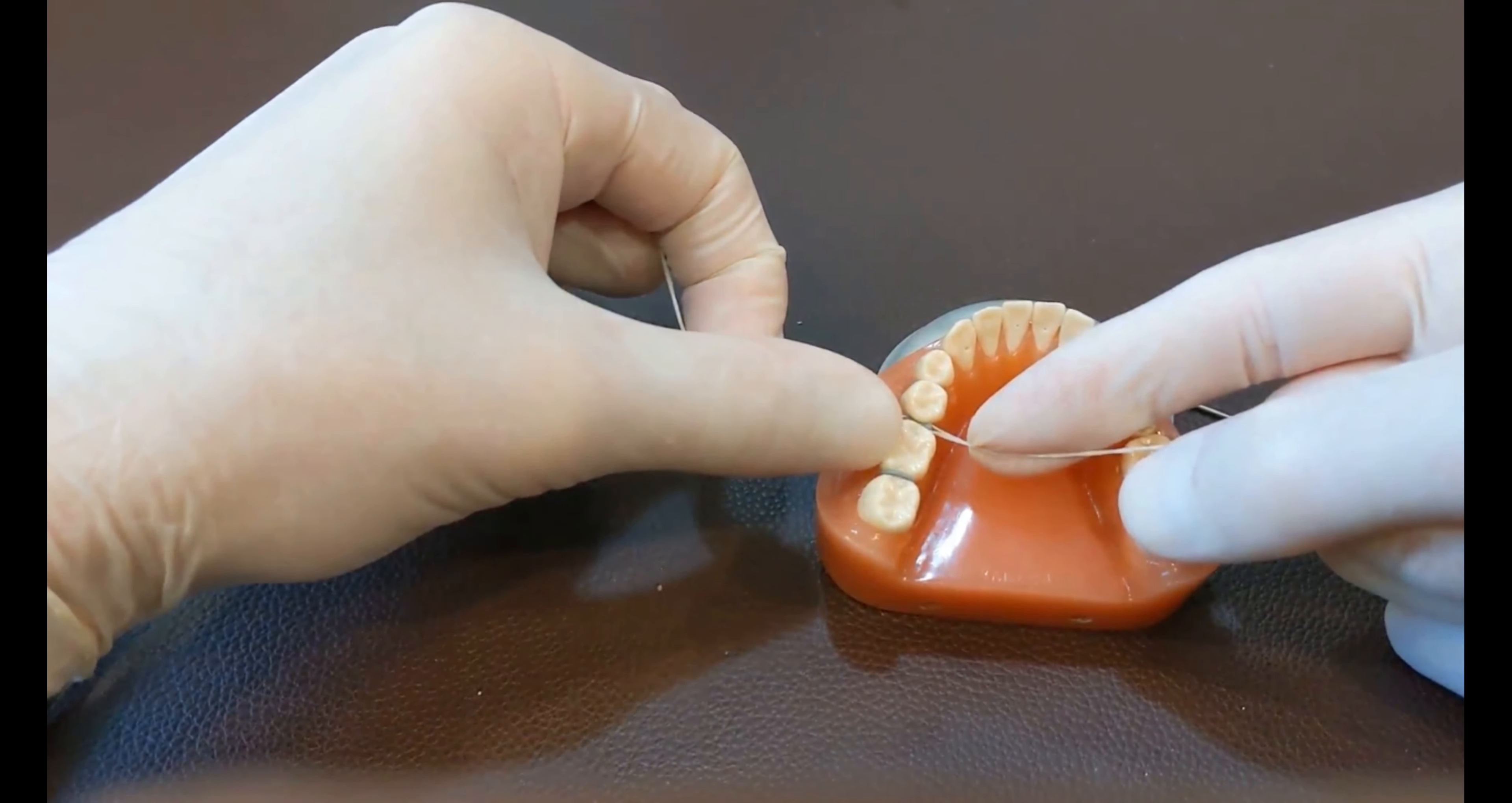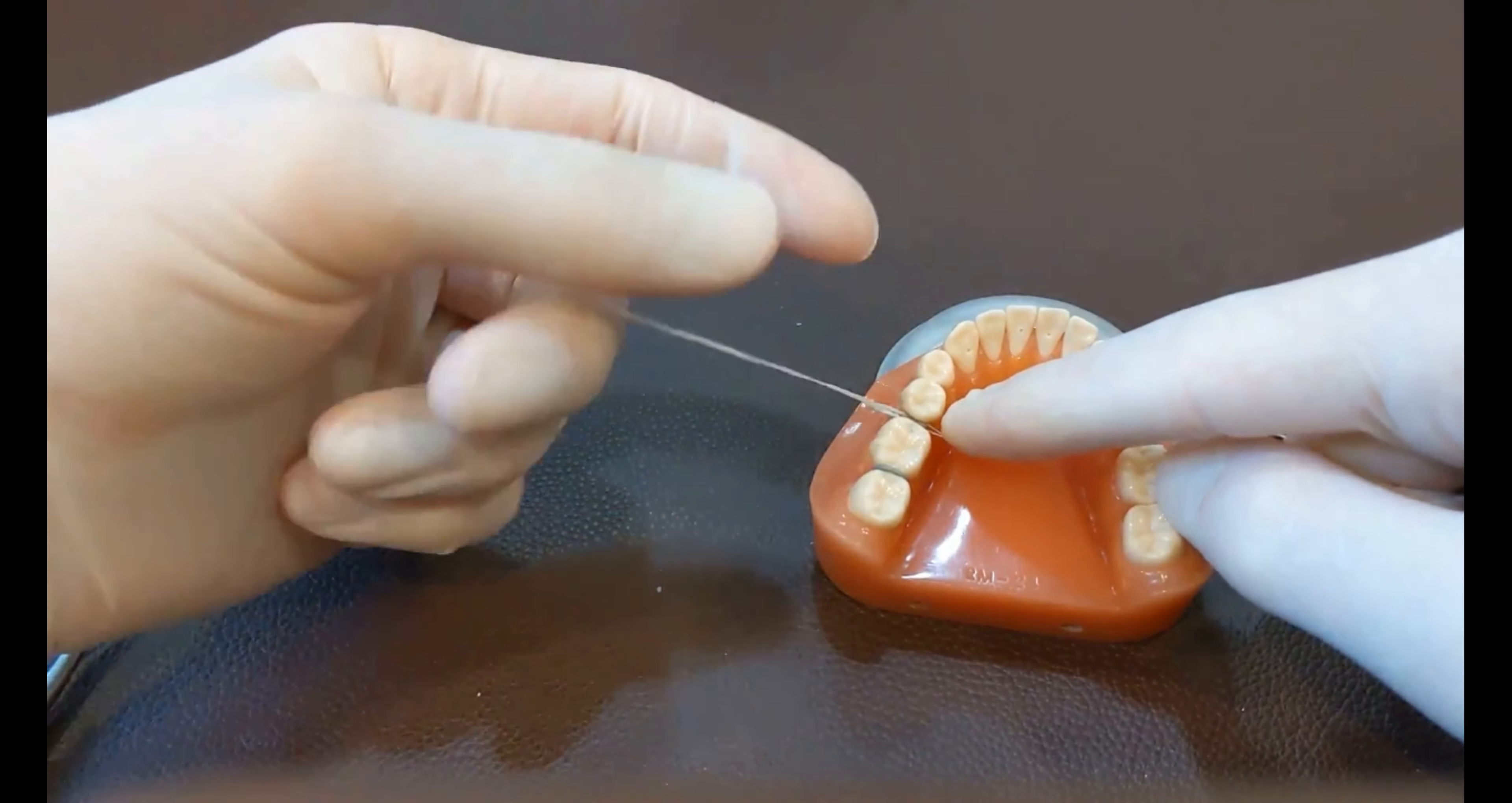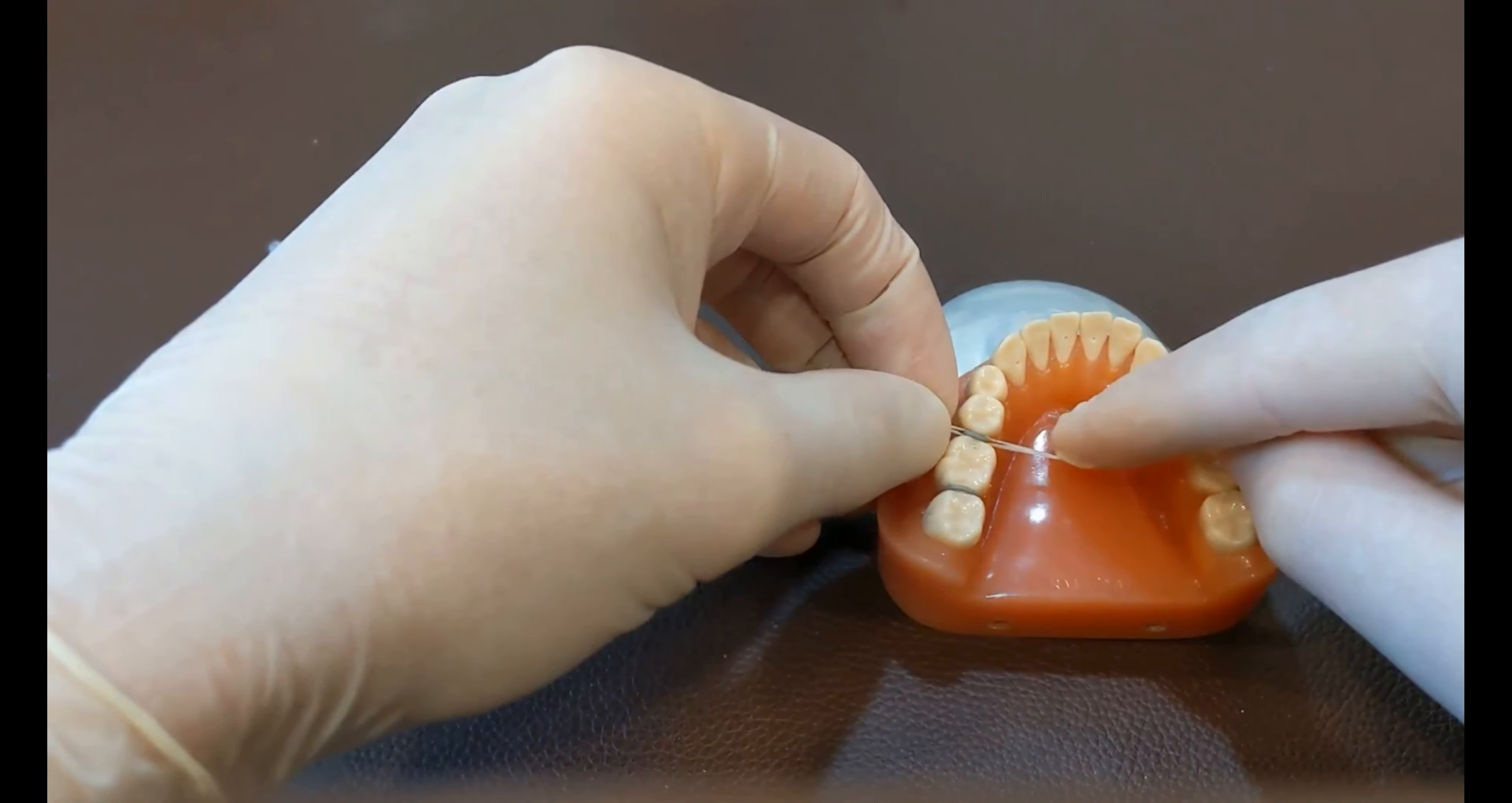And then you gently kind of wiggle it back and forth, and raise it up. See, both halves came out. So I gotta seat the floss back in there, pull it down halfway through, and then kind of gently raise it up until just one of those halves comes up above the contact, and the other half stays down below.